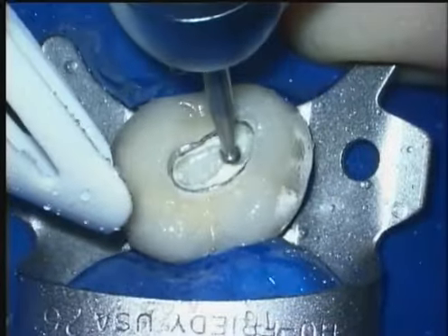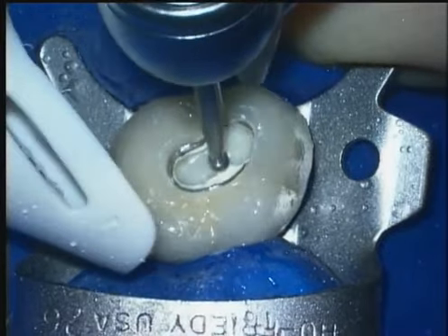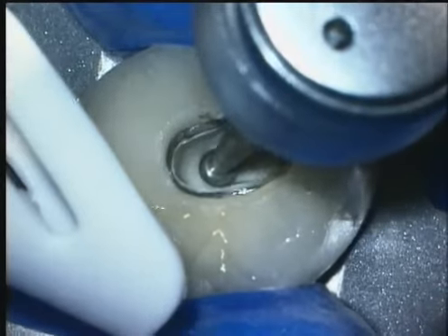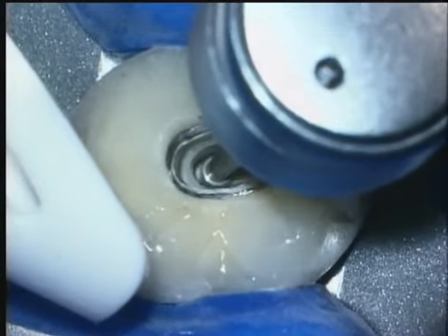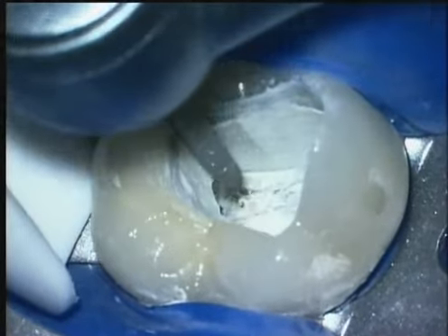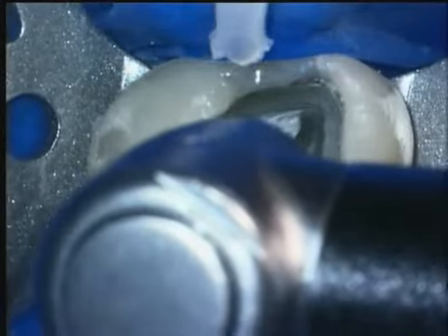A transmetal burr can make a window through the underlying metal, and then we use a surgical length round burr to drag up and de-roof the pulp chamber. Surgical length diamonds true up the axial walls and make them nice and flat so light can refract off them. GGs are run at 750 RPMs to marry the axial walls to the orifices.